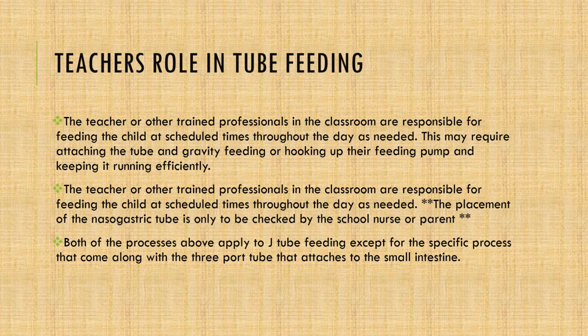Remember, the placement of the nasogastric tube is only to be checked by the school nurse or parent. Also, make sure to follow the specific process that comes along with the J-tube that attaches to the small intestines.